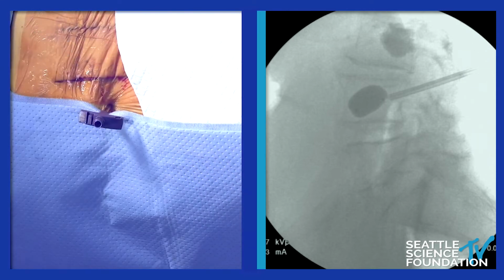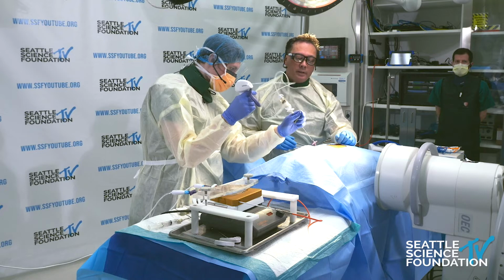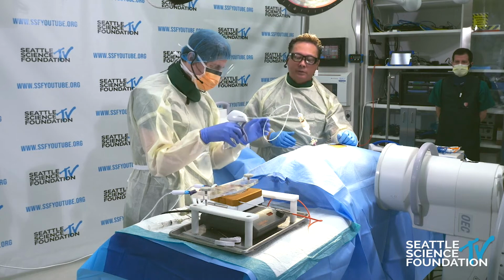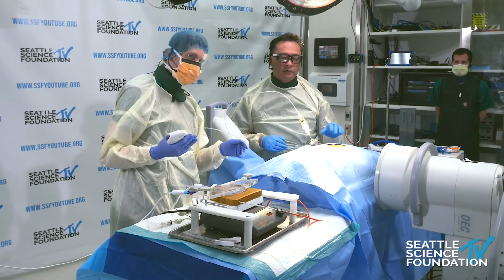We're removing the balloon now. We're going to get the cement here. So there's cement. We go through the slide of cement. This is the X-Speed cement. We're going to show the slide shortly here. The X-Speed cement from Medtronic has a setup time of 8 minutes before we have a high viscosity cement that we can deliver up to 16 cc's of deliverable cement.